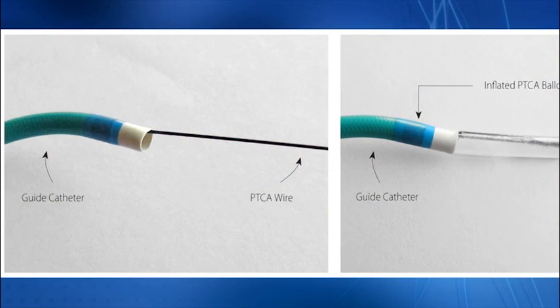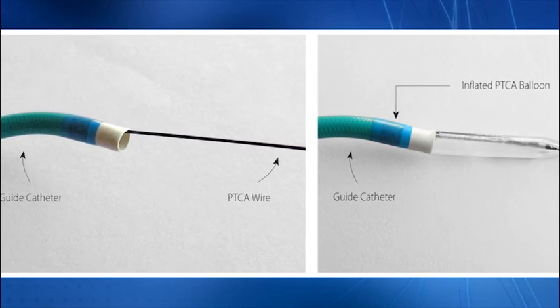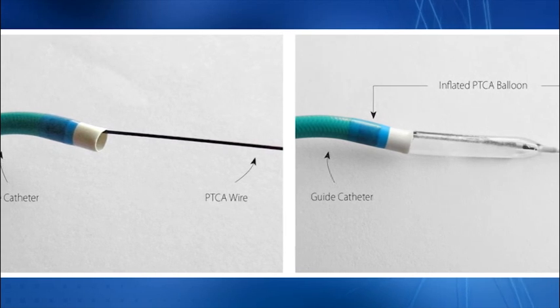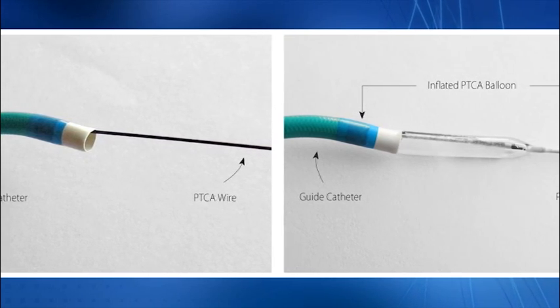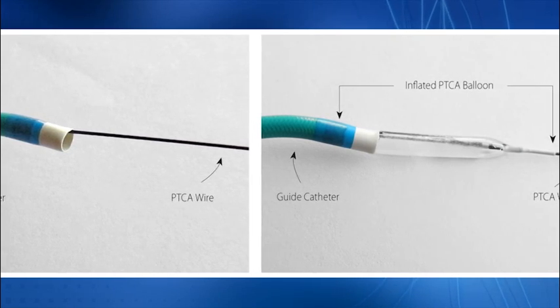At times you encounter a radial artery which has extremely small caliber or extreme tortuosity or atherosclerotic obstruction. Sometimes it is difficult to track a diagnostic or a guide catheter further. Repeated attempts to negotiate a catheter will increase the chances of spasm, pain and discomfort and also perforation leading to hematoma. We have developed a very effective technique for working through these difficult segments.